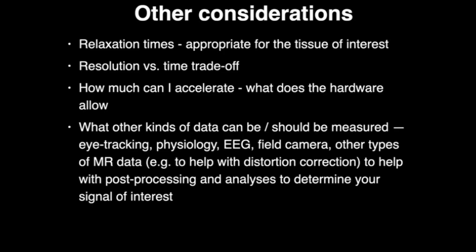One aspect of image processing and reconstruction I didn't even talk about here was using acceleration. This is where, with how we encode data in Fourier space, there are techniques that let you skip some of that data, but then use information about geometries to fill that information back in. There are signal-to-noise trade-offs and other penalties. So, again, it takes careful thought about how you make those trade-offs.